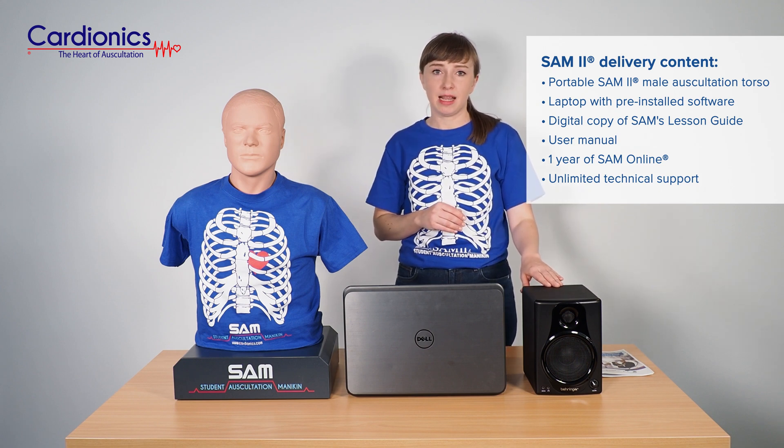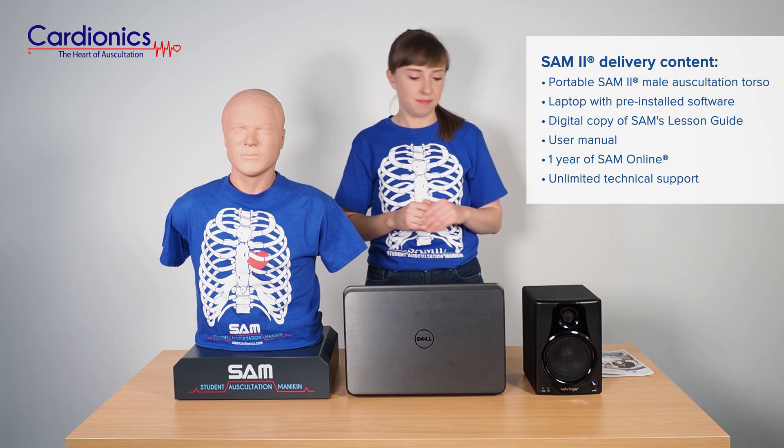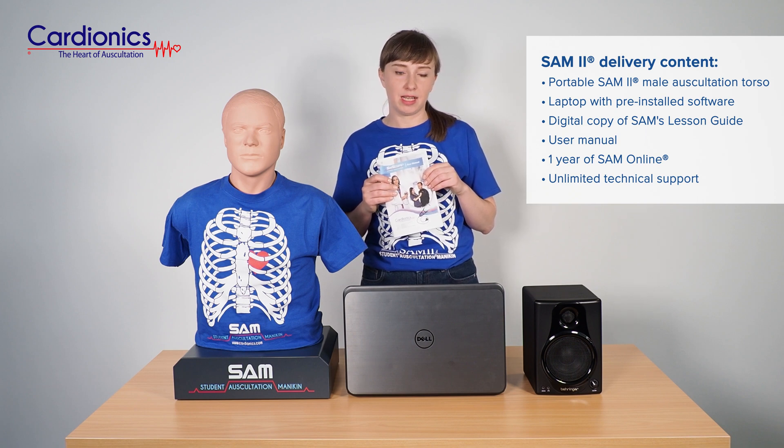An optional speaker system allows a larger group of students to participate in the lecture. And a product manual, which is also available online.